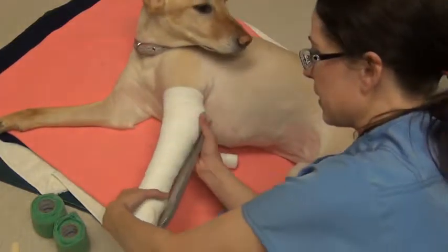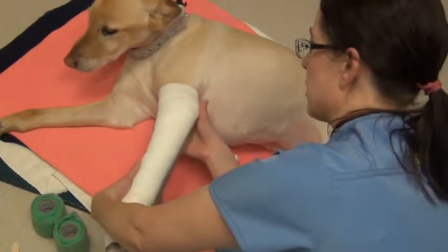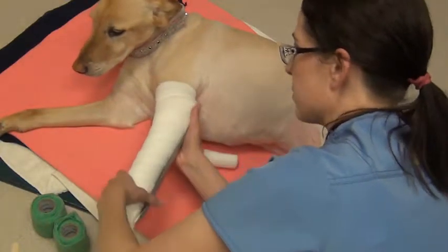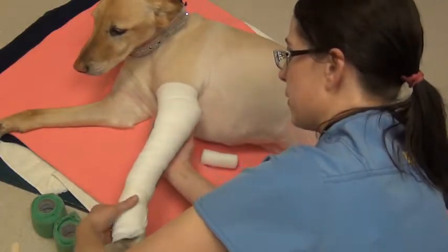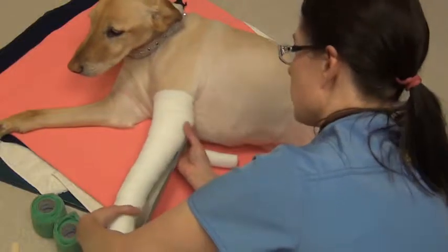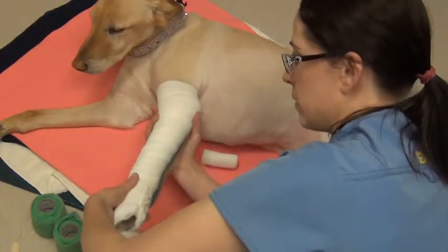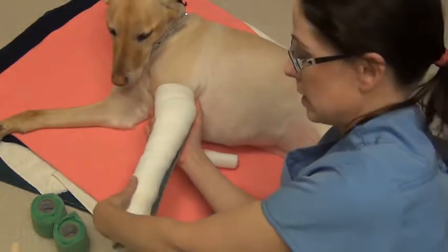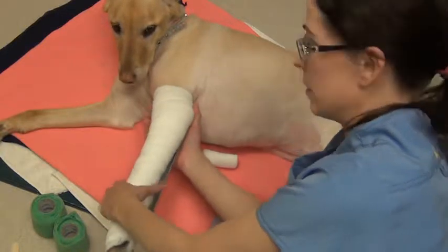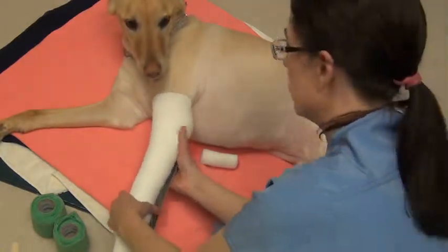So this is obviously not a splint that I would want to keep on her. I would want to find something that's appropriate for her size, and it just barely comes to her elbow. We want it to come up a little bit further. So we would not leave this one on. It would not be proper to use. But I'm just going to wrap the leg for the purposes of the video. We would want a longer splint, but we are limited on our supplies here.